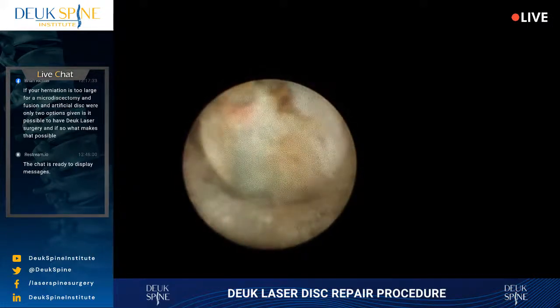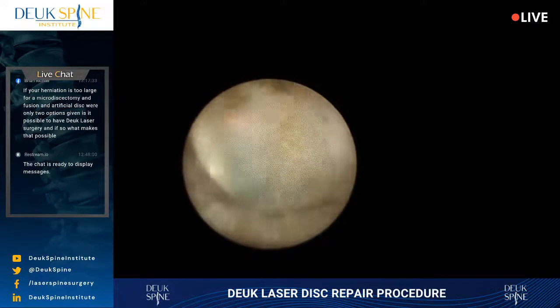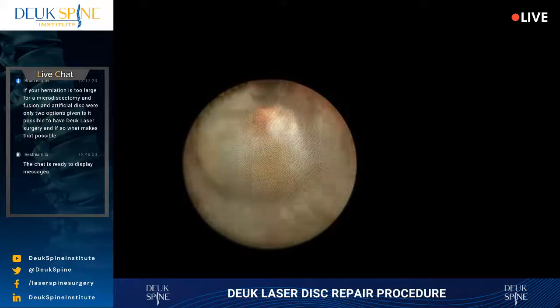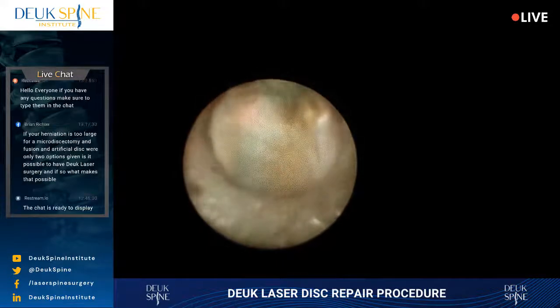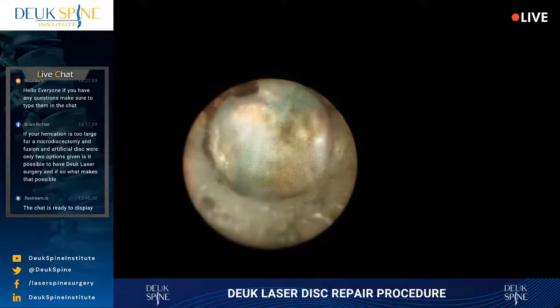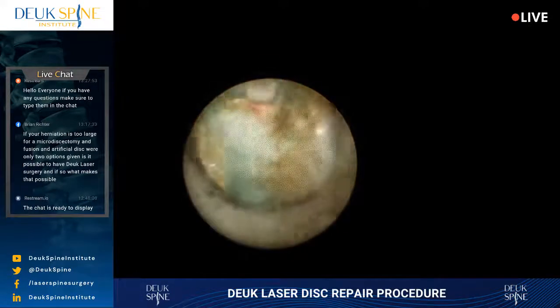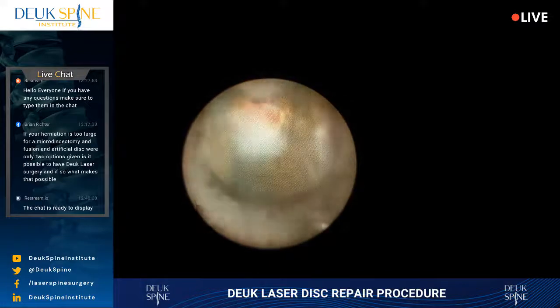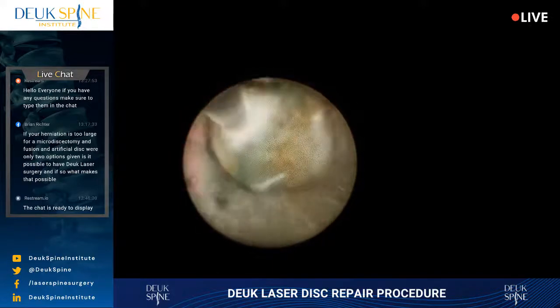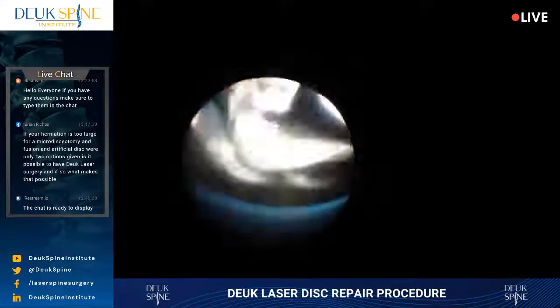I have not found a herniation I can't remove and give the patient what they want, which is the elimination of their symptoms. Now, there are situations that are not common where herniations actually move up or down the spine after they come out. What I'm doing right here is fixing a herniation that is right behind the disc. There it is. There's a piece of the herniation right there. See that? Bam. Pretty cool.